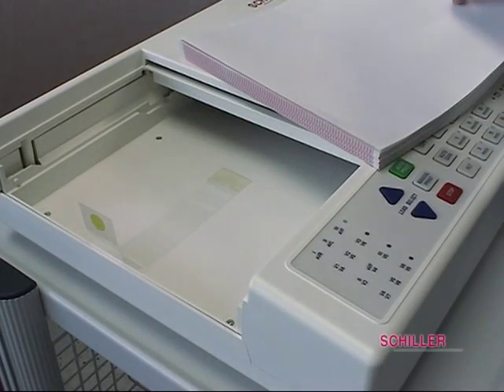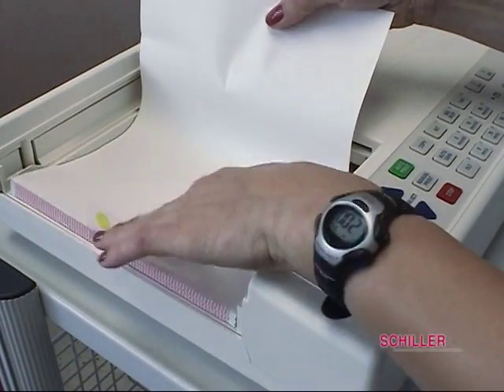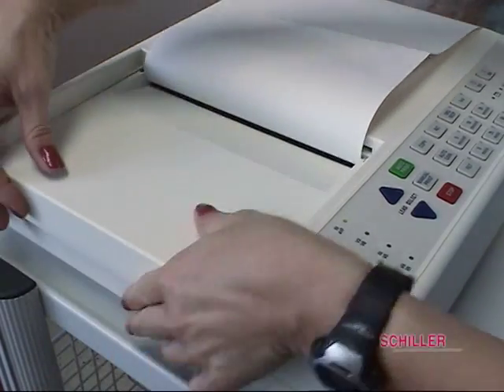Make sure a segment or full sheet of paper is overlapping to the right of the unit. The plain side of the overlap sheet will face you. Slide the tray along the rails until you hear the tray click back into place.